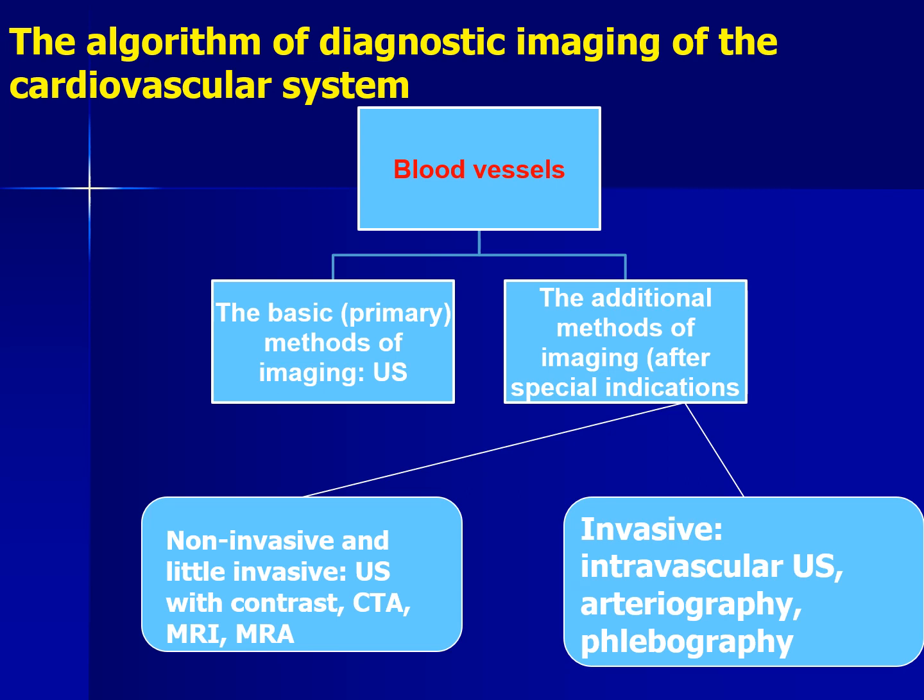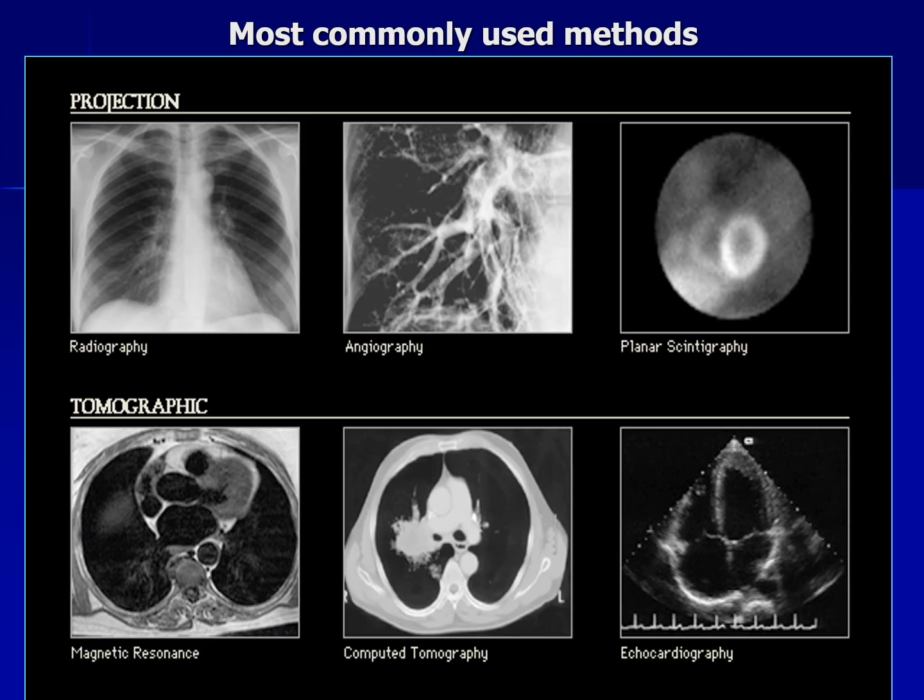What are non-invasive and little invasive? Ultrasound with contrast, CTA, it means CT scan with using contrast agent, MRI examination, and also MRI with using the contrast agent. And invasive: intravascular ultrasound, arteriography, and phlebography.